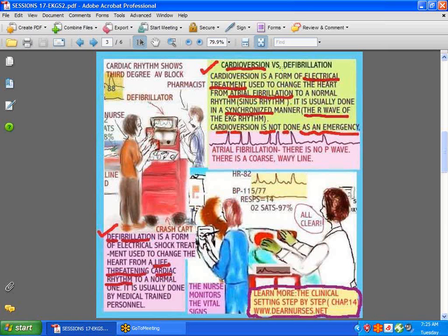Unlike defibrillation, cardioversion is done for atrial fibrillation where the patient is not in as lethal a rhythm. It's done in a synchronized manner — you wait for the R wave to shock the patient. The hope is that it will convert the patient back into normal sinus rhythm. Here you can see the nurse assisting the doctor, who holds the paddle and shouts 'all clear.' For more on this topic, visit dearnurses.net, Chapter 14.